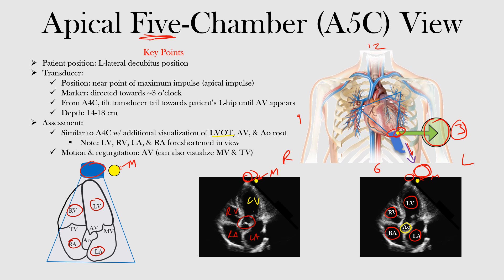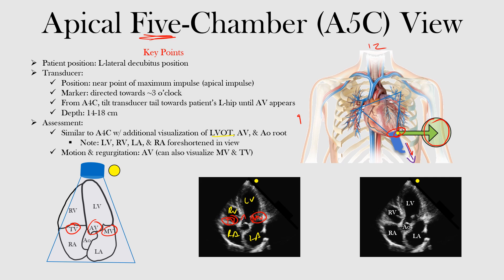The three valves you can see in this view are the ones between the atrium and the ventricle — the AV valves — as well as the aortic valve. We have the mitral valve between the left ventricle and left atrium, and the tricuspid valve between the right atrium and right ventricle. The aortic valve sits right in between as the left ventricle goes out to the aorta.